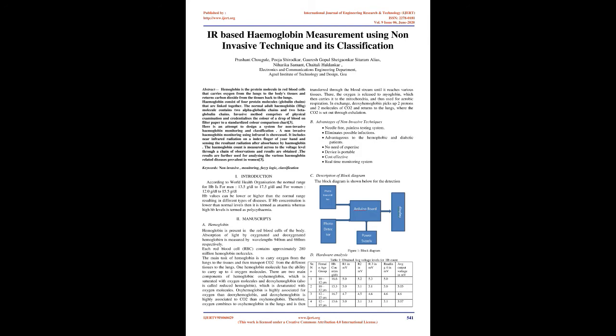The invasive method comprises physical examination and comparing the color of a drop of blood on filter paper to a standardized color comparison chart. Here is an attempt to design a system for non-invasive hemoglobin monitoring and classification. A non-invasive hemoglobin monitoring using infrared is showcased.